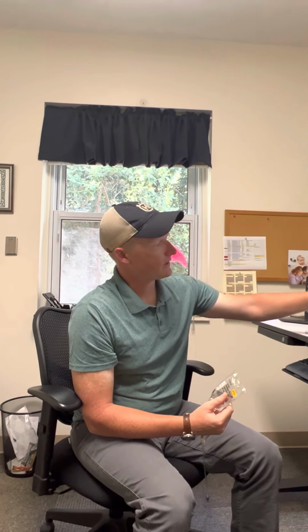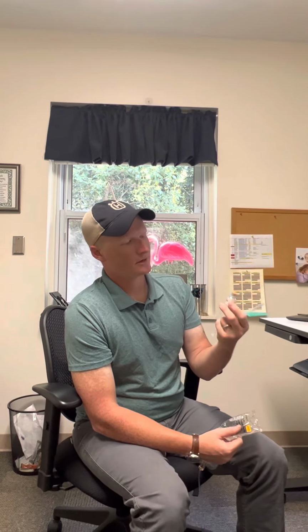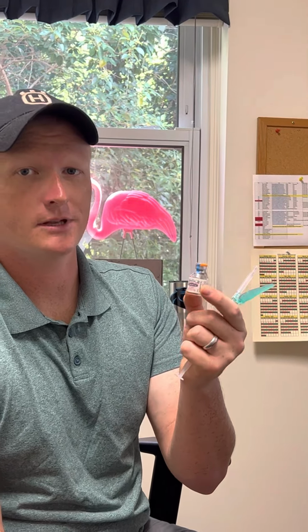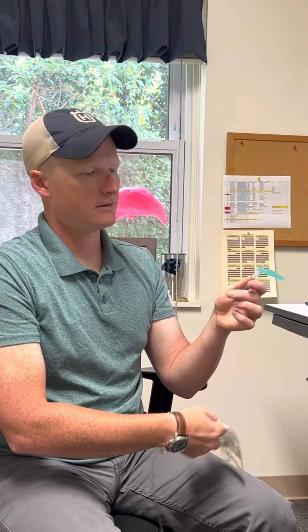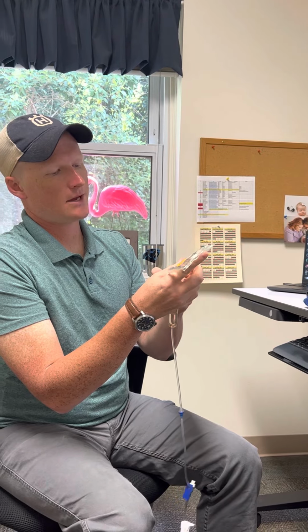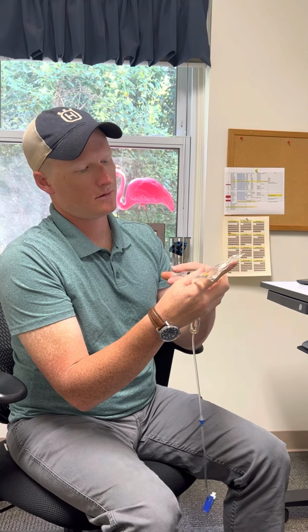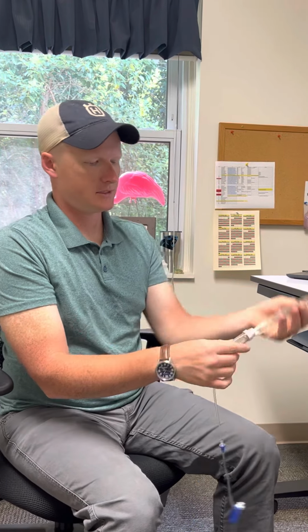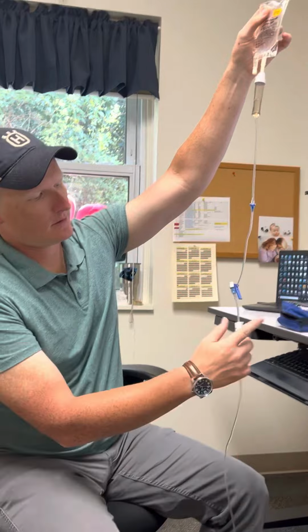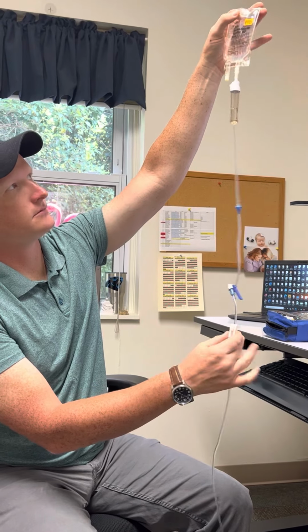So how are we going to mix this up? You get your 500 vial of ketamine. Concentration is 100 milligrams per cc. So let's say my patient weighs 100 kilograms, so I'm going to give them 200 milligrams. I'm going to draw up my 2 cc's of ketamine, take that, put it in the bag, get it all mixed up. I'm going to hang it and then just let it go, wide open.